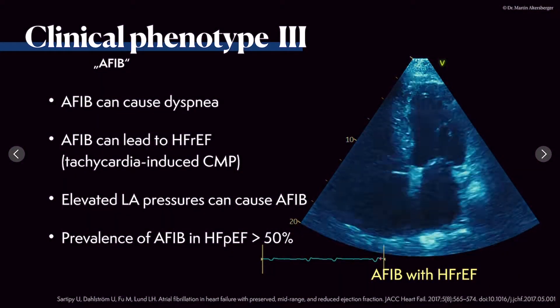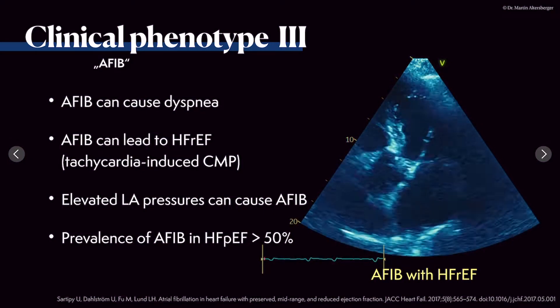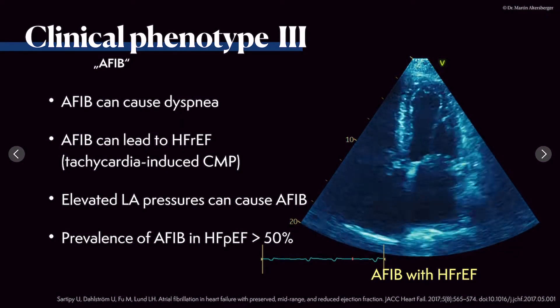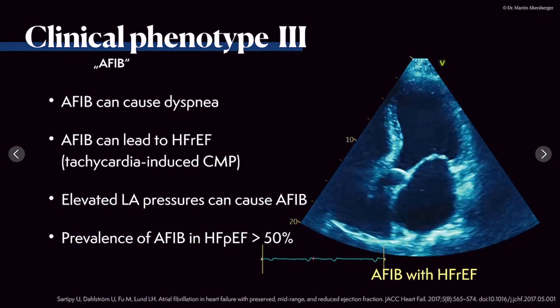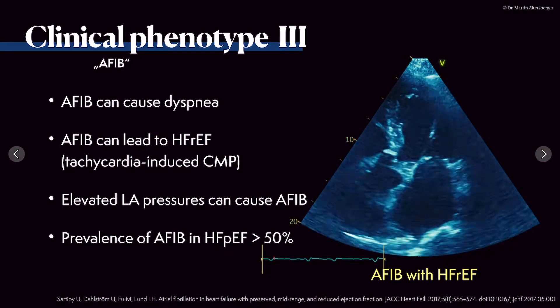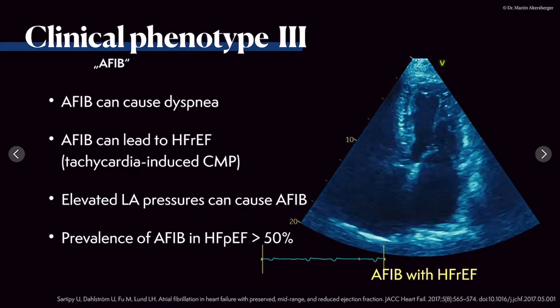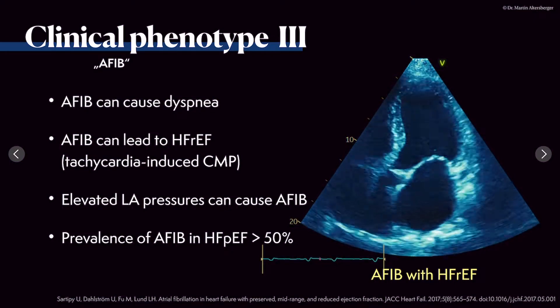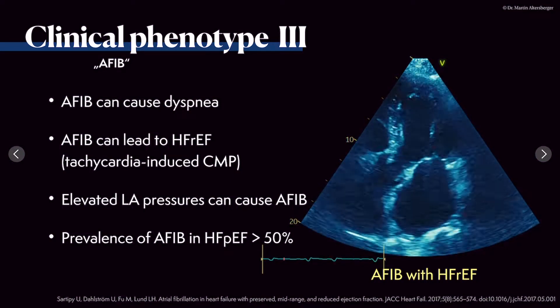Let's move on to clinical phenotype 3. This can be a little bit tricky because here I brought an example with atrial fibrillation and a case of heart failure with definitely reduced ejection fraction — below 40%, visually in the range of 30%. I brought this example because it nicely shows what the problem of a patient with atrial fibrillation can be. Atrial fibrillation can, per se, cause dyspnea, but it can also lead to heart failure with reduced ejection fraction because it's a tachycardia-induced cardiomyopathy.